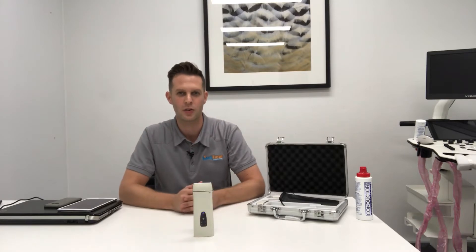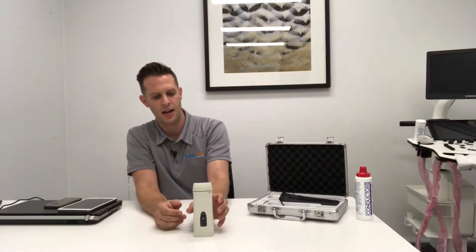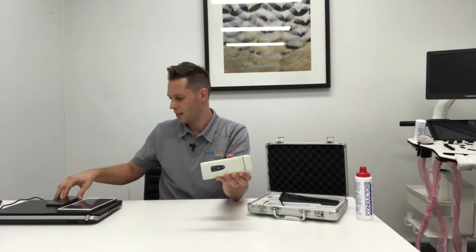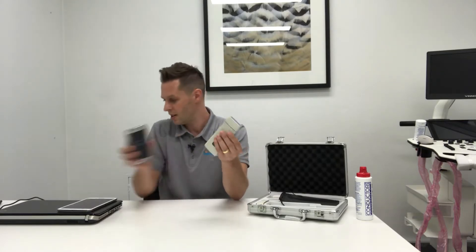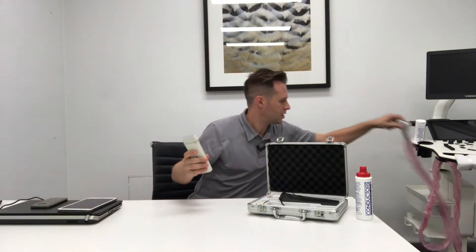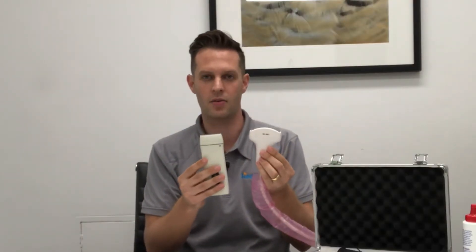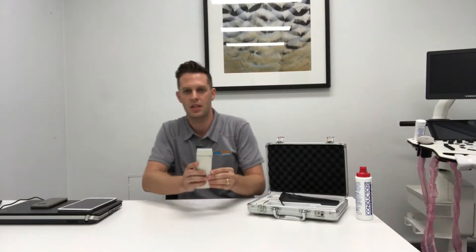Hey guys, I'm Stuart from Real Time Ultrasound and today I'm going to be giving you a quick review on the new pocket ultrasound system from QSono D8. This is their second generation pocket ultrasound system and as you can see it is truly a pocket-sized ultrasound system — it's not much bigger than your standard mobile phone.